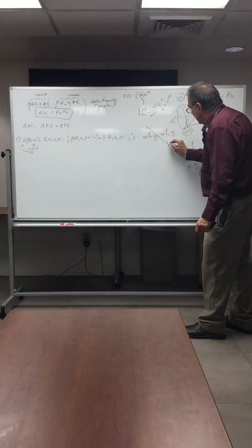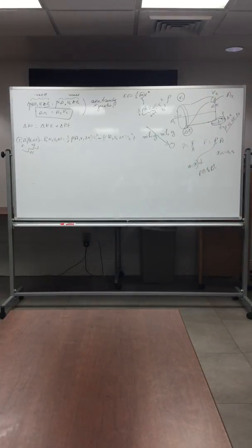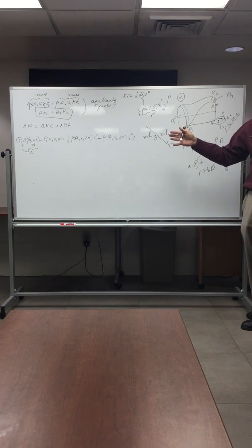This term can be neglected because it tends to be very, very small as compared to the other large term, okay? So I'm fudging mathematics here a little bit. Make sense? Okay. So, since the distance between these two things on the heart is very small, about that size, okay? When you're measuring an aortic valve, you're measuring the velocity right here and right here. And that is usually less than 0.5 centimeters. For all practical purposes, the potential energy is going to be the same. So I can discard this term to simplify the equation even more.